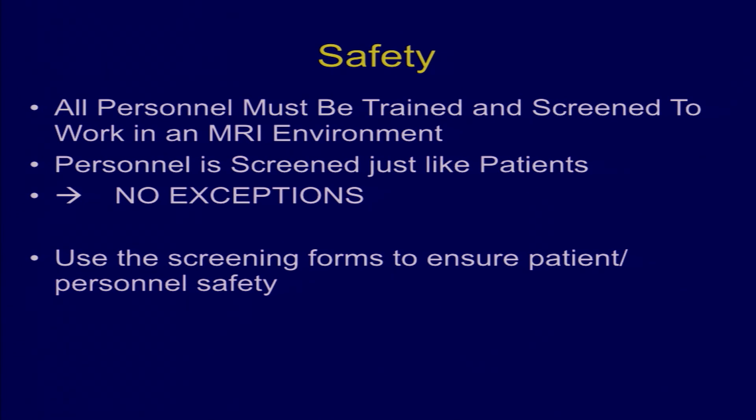And therefore, we want to use screening forms on every single patient that comes through the lab. And this is very, very serious. Sometimes it's one of those things where you can just go checkbox, checkbox. But this is very serious because there are cases where people were lax in doing the screening and put the patient into the scanner, where disasters can happen.